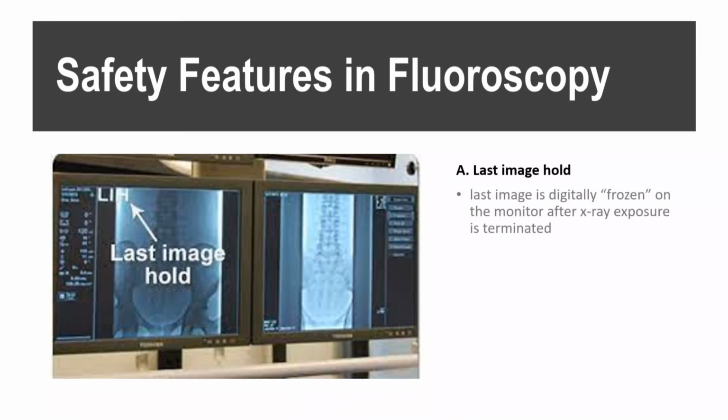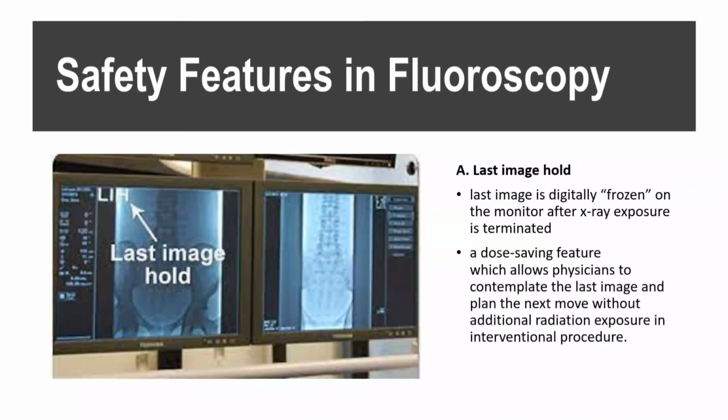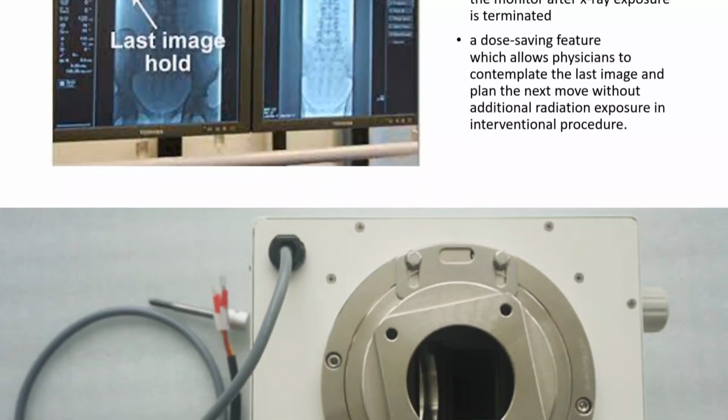The first one is the last image hold. The last image is digitally frozen on the monitor after the X-ray exposure is terminated. This is a dose-saving feature which allows the physician to contemplate the last image and plan the next move without additional radiation exposure in interventional procedure.